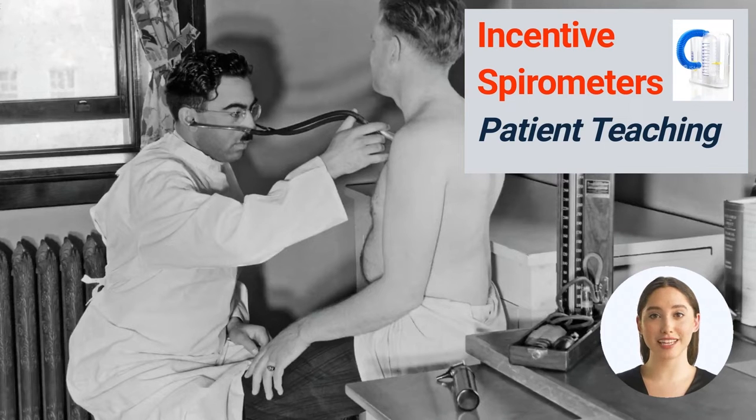Hello friend. Thank you for taking this quick review of incentive spirometers. While studies have shown that the utilization of IS improves lung volumes and reduces the rate of pneumonia in post-surgical patients, early ambulation is still a top priority to promote the blood flow of oxygen for quicker wound healing.